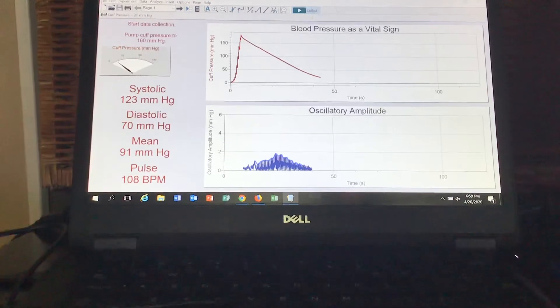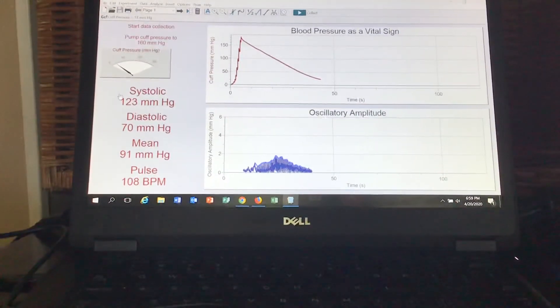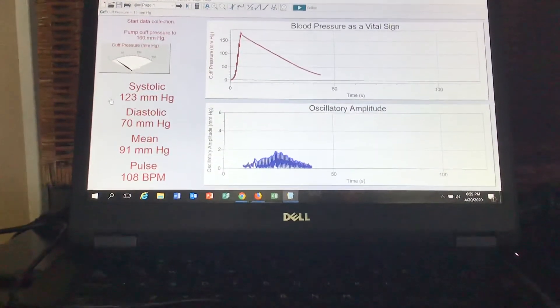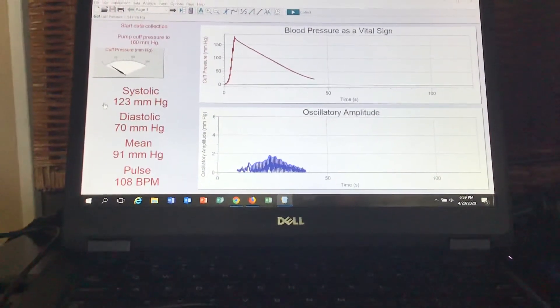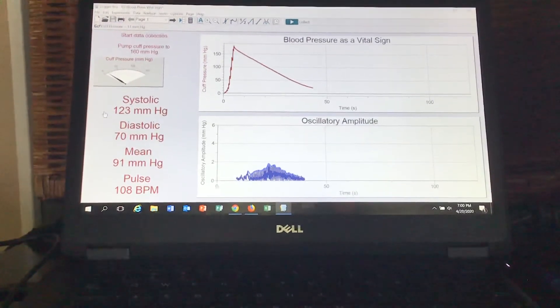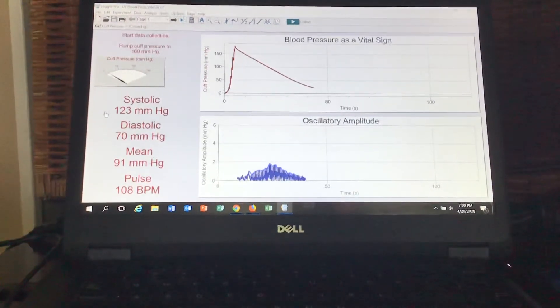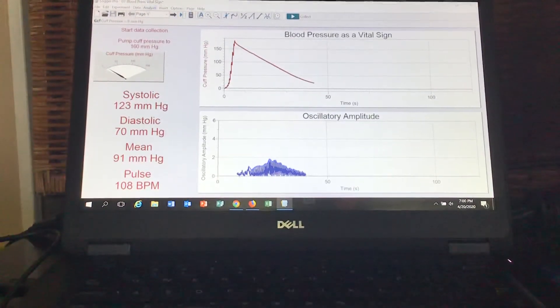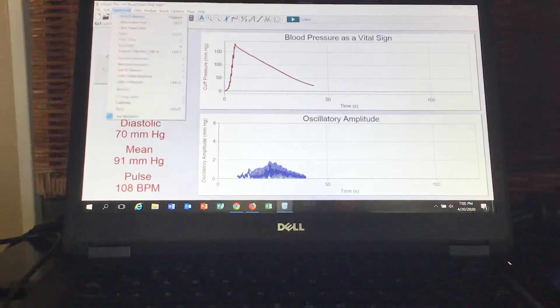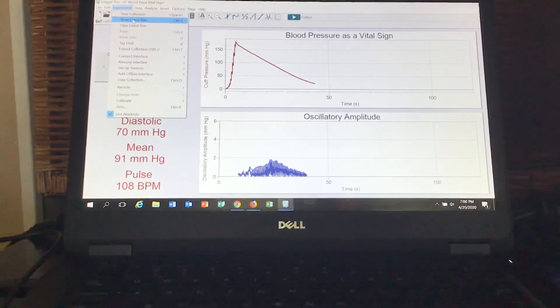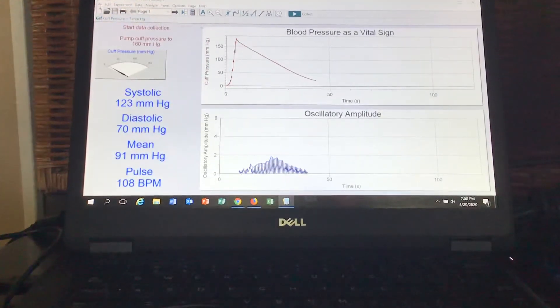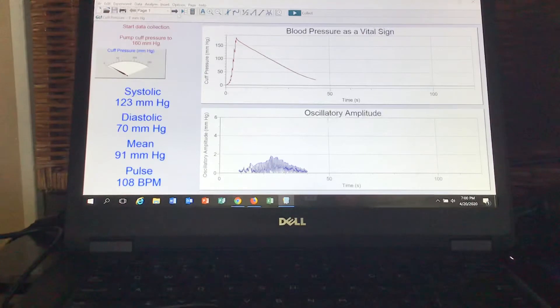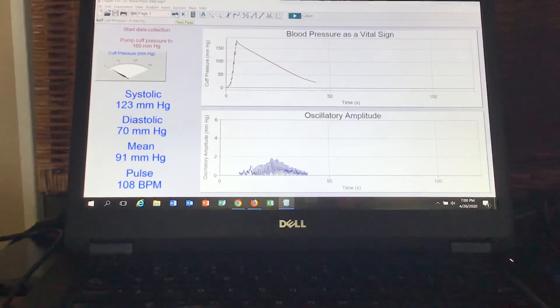And there you go, so there's your numbers: 123 over 70. And with this program, which is pretty cool, you could actually store that - store latest run - and then you could retest multiple times between you and even a partner.